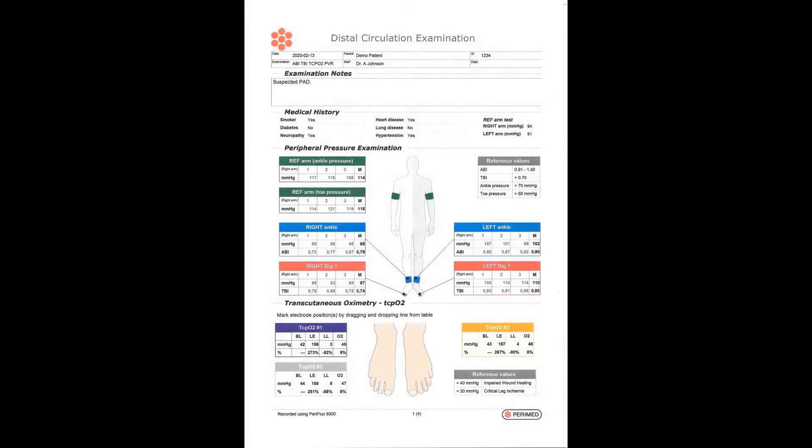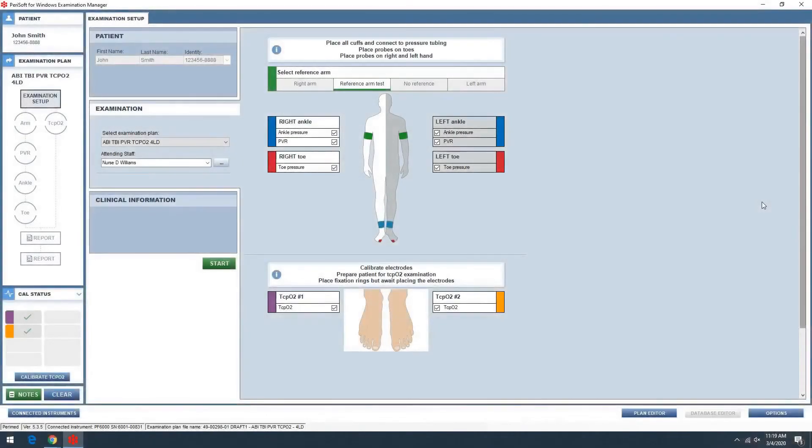Reports are customized to meet the requirements of the hospital and can be more or less extensive. The examination is streamlined and it's easy for a clinician to adapt the measurement to fit patients with AV fistula, amputations, or contraindications that affect the standard procedure.